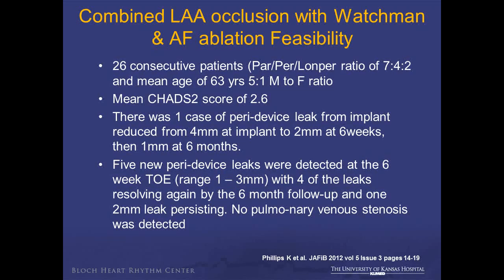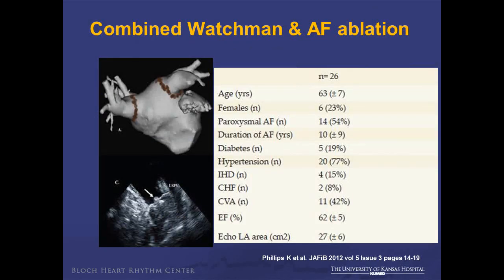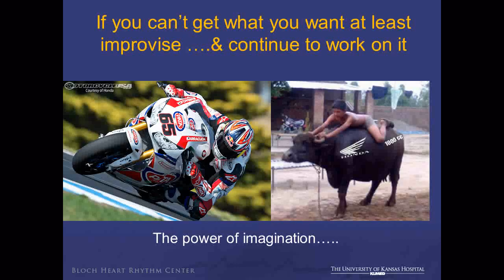Then you have the Watchman with simultaneous AF ablation. This is not only possible, but it's reasonably safe. This is a small data set from Karen Phillips' group from Australia looking at the feasibility and safety of it.